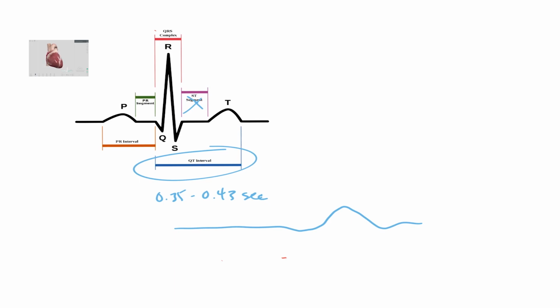Many times the electrolytes that you're giving or not giving the patient are going to cause a lot of these EKG changes. So you really need to watch over that closely. Talk with your doctor. You are the nurse. You are at the bedside. You need to be able to look at the patient. Yes, the alarms are pretty important, but the patient first. Look at your patient. Is he or she not acting right? Discuss and talk with them. Then talk with the doctor and say, hey, I think the EKG numbers are off, and my blood results confirm that. Let's talk about it before something bad happens.